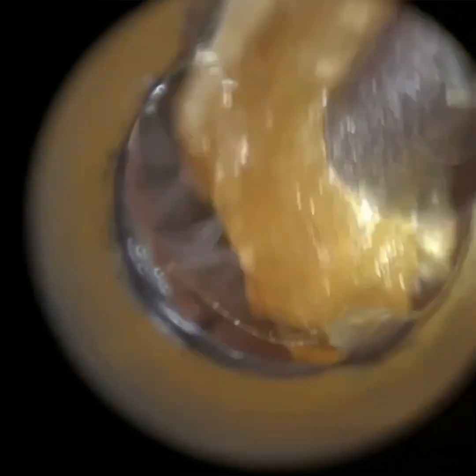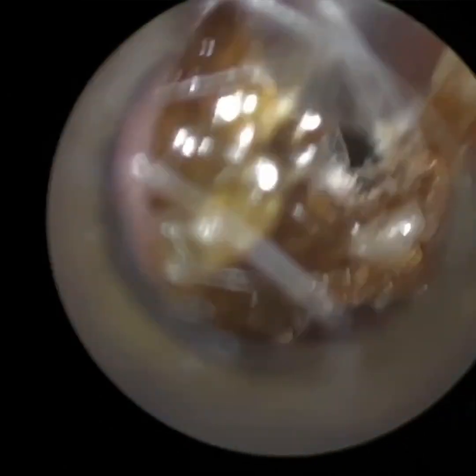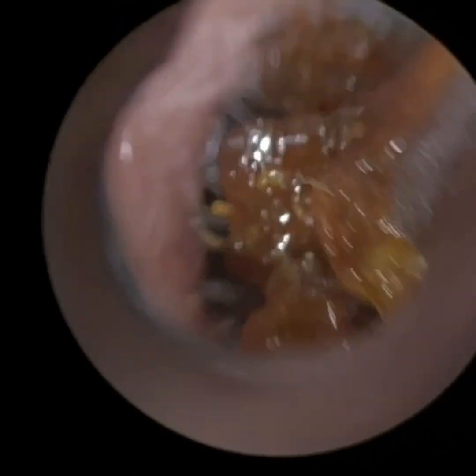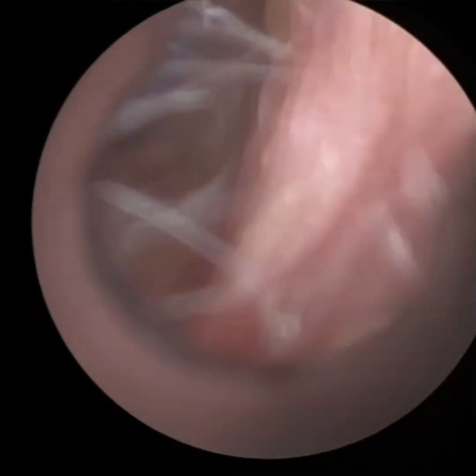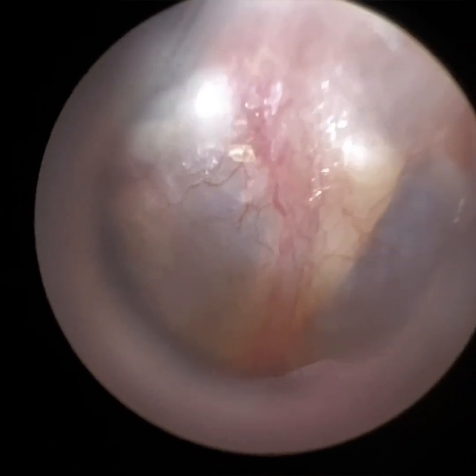What benefits did I find with the Waxcope compared to the endoscope in this particular case? I'm still strongly of the opinion that the endoscope is unrivalled, but I found that the speculum helped to stabilise the patient, and the Waxcope kind of locks it in place, which is great. If someone asked me what I'd use in complex cases, more often than not I'd use the endoscope. However, there was a case — I'll try to upload it in the next week or so — where I started with the Waxcope, struggled, reverted to the iClearscope, struggled again, and felt I'd actually be better with the Waxcope. I went back to it and felt more comfortable. It's the first time I've ever had to revert from the endoscope to the Waxcope to complete a procedure, and I was really chuffed with that.